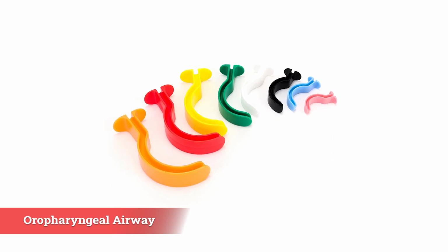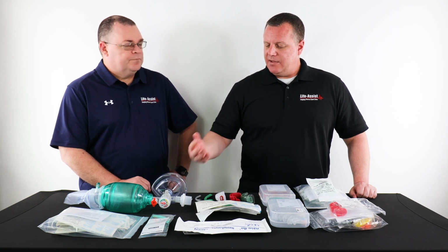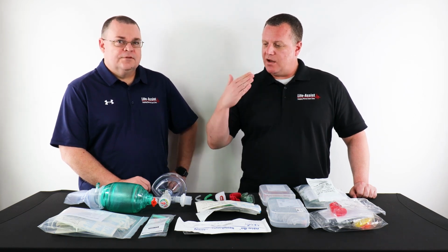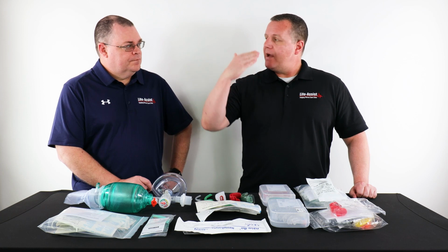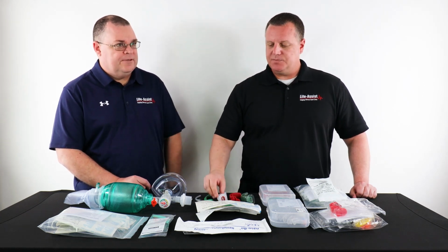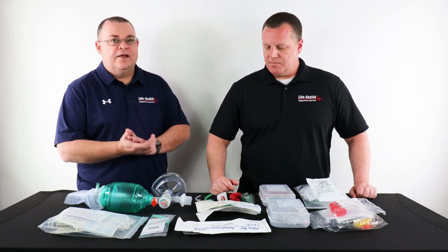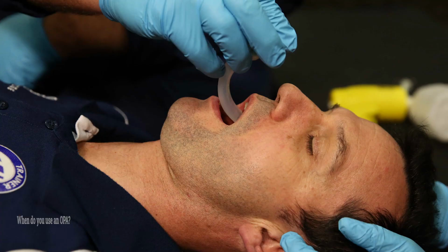So what does an OPA do? An OPA, simply enough, keeps the tongue from falling back and blocking the airway. And so it helps you establish a clean airway so you can administer care, right? Absolutely.